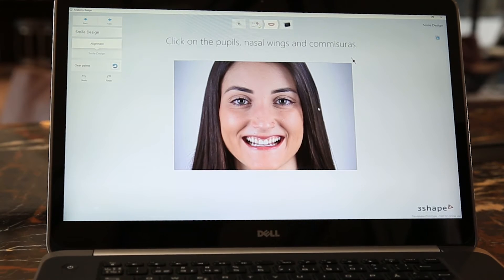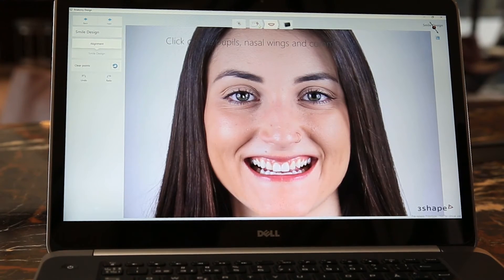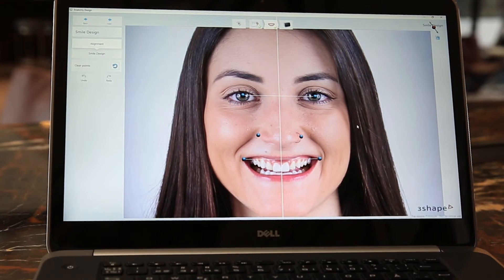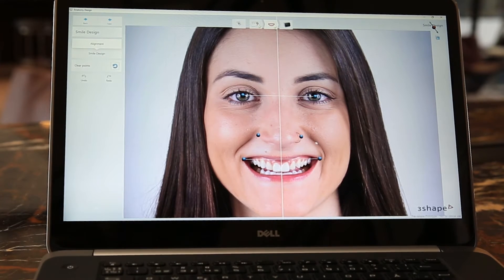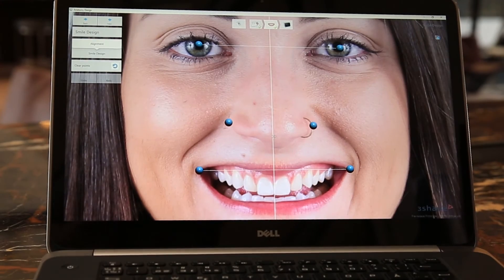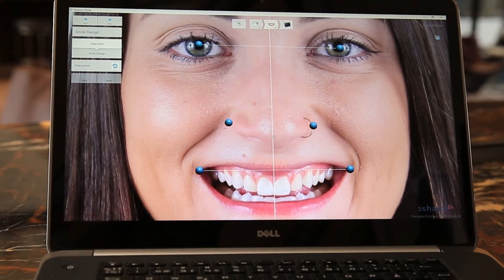This is the smile design software. It will ask me to input some points on the pupils, the nasal wings, and the commissures. Afterwards it will align the photo according to digital smile design principles, and here I'll have the ability to adjust the midline accordingly.